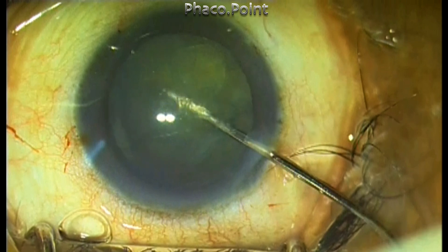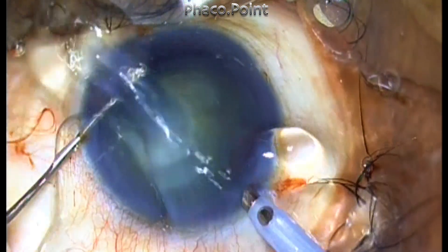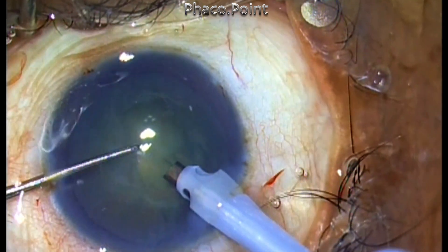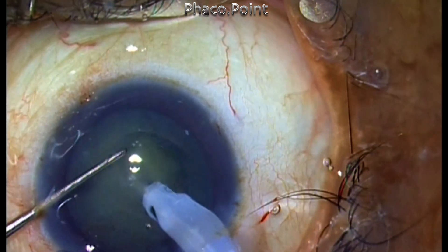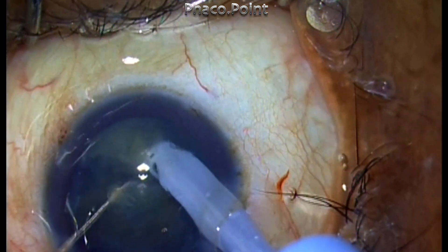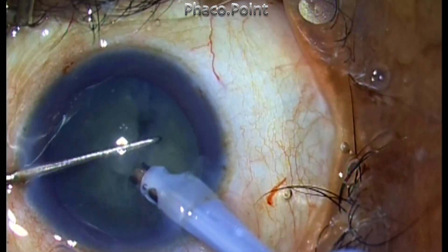The problems you need to bear in mind while performing phaco in a small rhexis is that you may inadvertently nick the anterior capsule when creating the direct chop. However, if you are aware of the edge of the capsulorhexis and carry the sharp tip chopper into the substance of the nucleus in the mid-peripheral zone, this disaster can be averted.